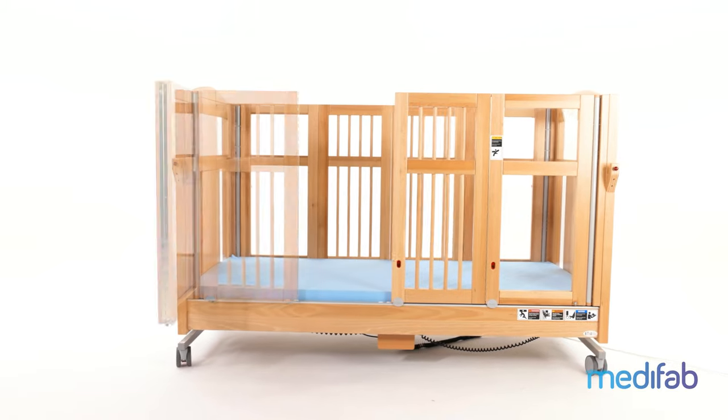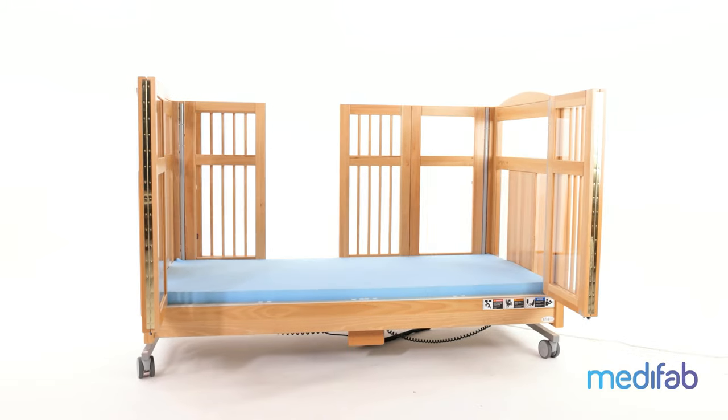As a general guide: if the user is pulling to a high kneeling or can stand, both the 135 and 170 beds may be effective. If they are not currently — or ever likely to — pull to high kneeling or standing, I would recommend the smaller Genie bed, which you can see in another video.